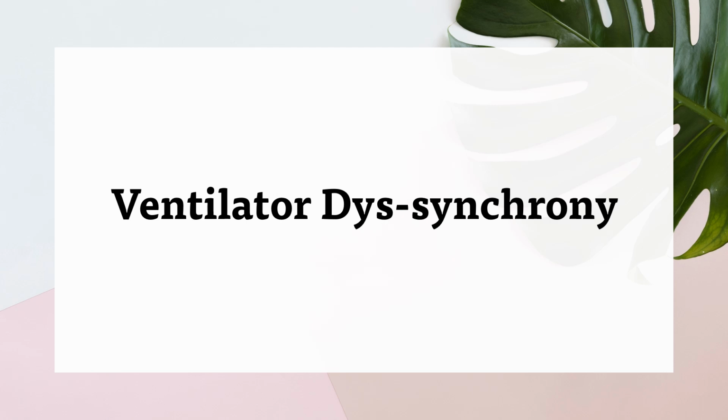What is ventilator dys-synchrony? What are the different types? How are they identified? Why are they relevant? And what are the general management principles?